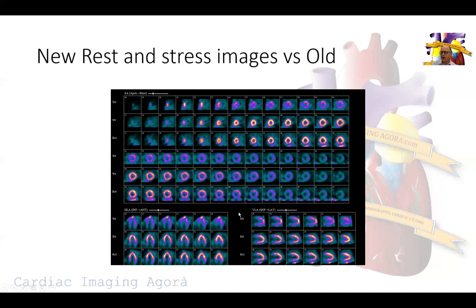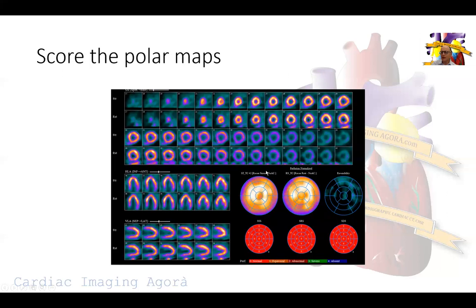This shows you that performing quality assurance on the images every single time can lead you to detect artifactual changes. In this instance, despite having software to remedy some motion artifacts, the remedy was to put the patient back on the camera and re-image them. Now we have a completely normal study as seen from the polar maps and perfusion images - we salvaged the study.